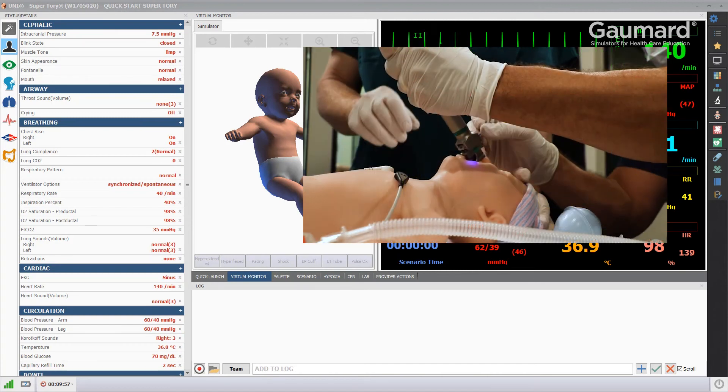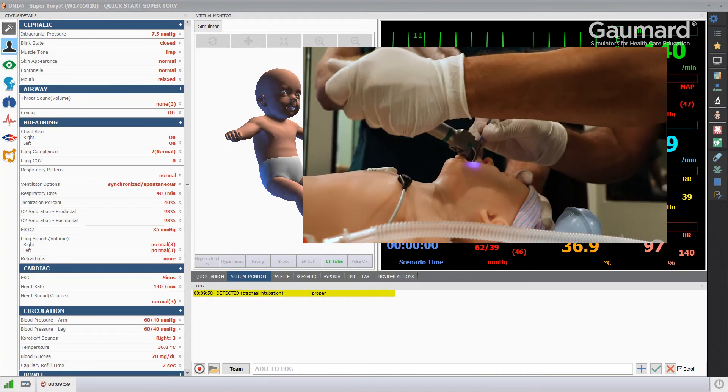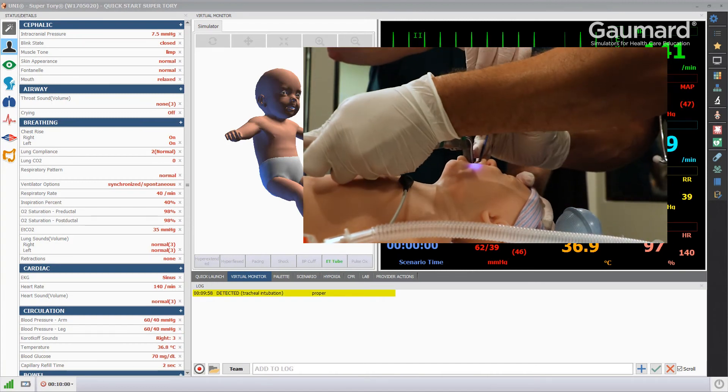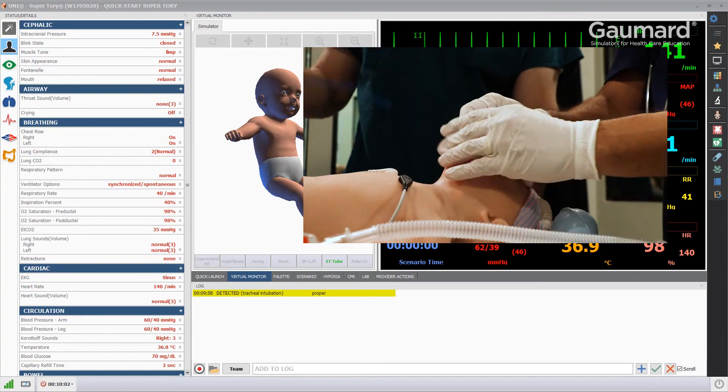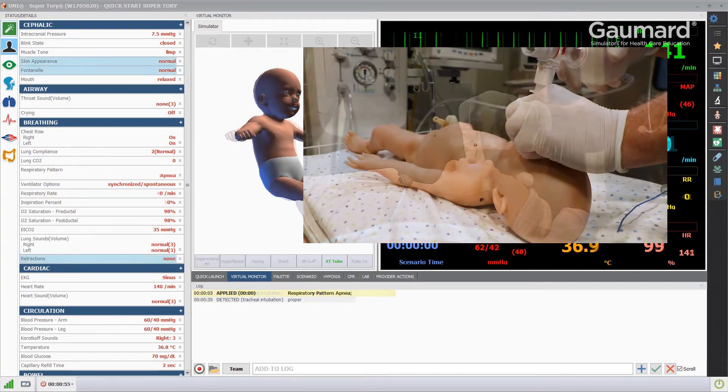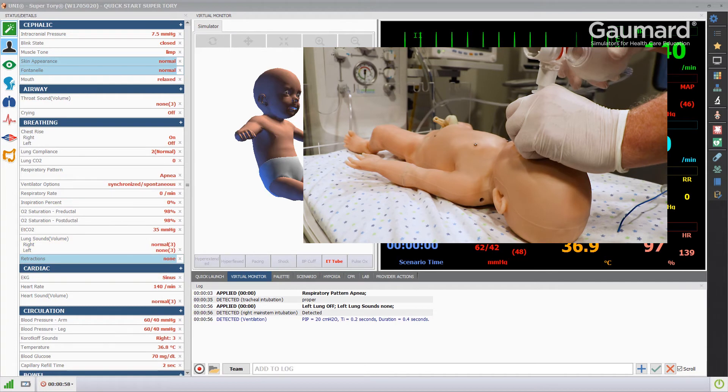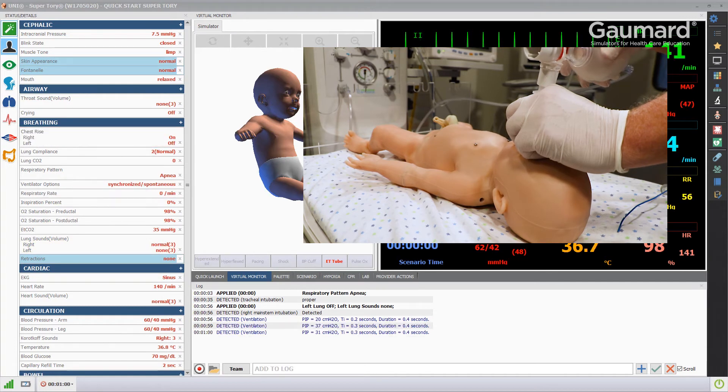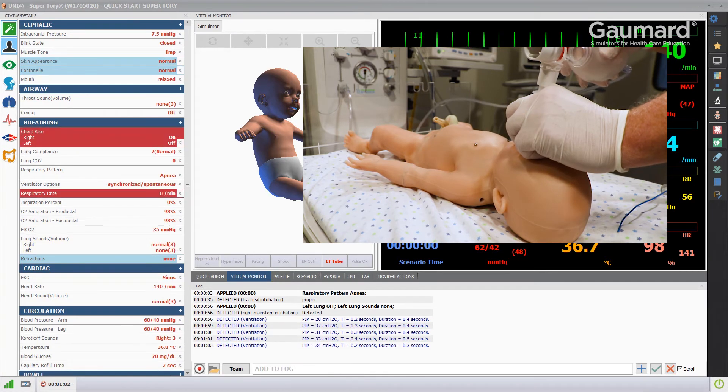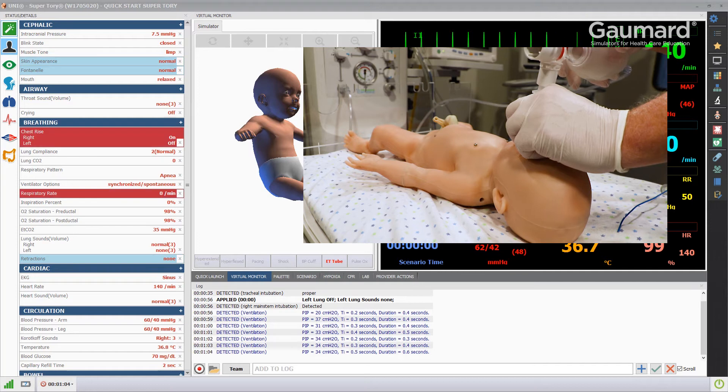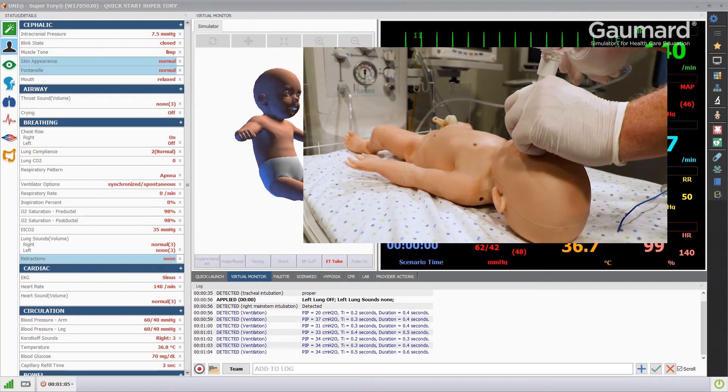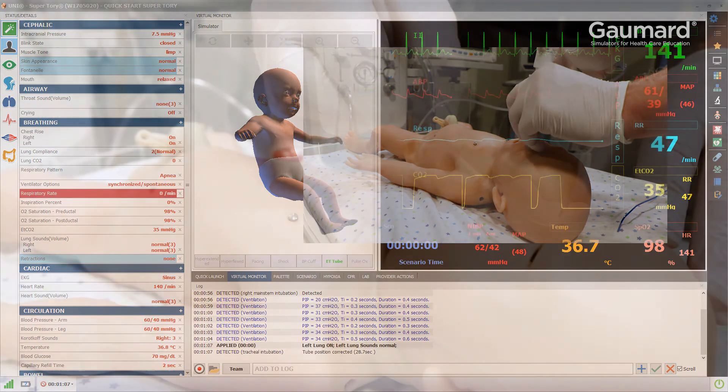The software will automatically log proper tracheal intubation. Right main stem intubation will also be detected and the left lung will automatically be disabled. Once corrected, the software will document the correction, note the time it took to correct the position, and reactivate the left lung.